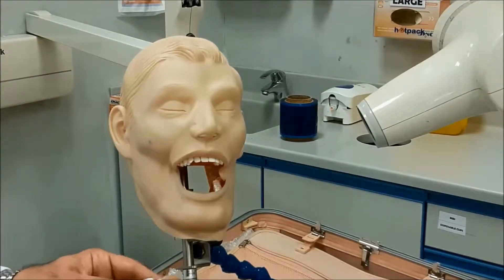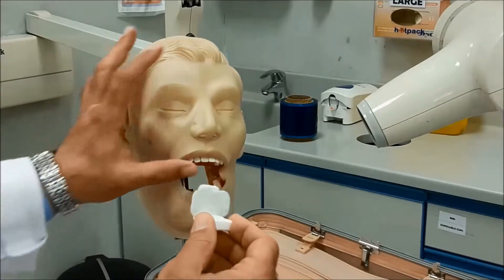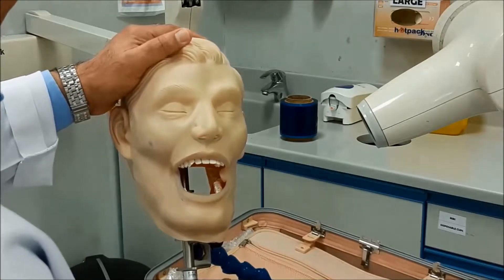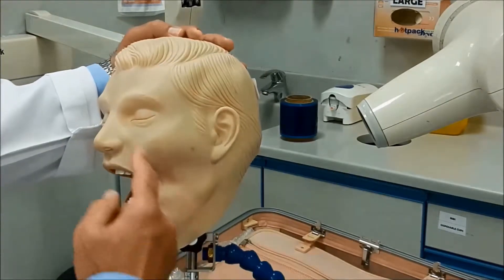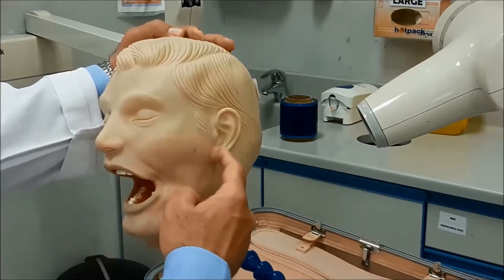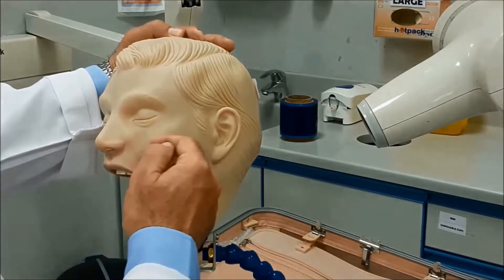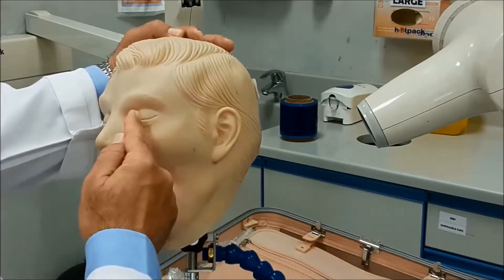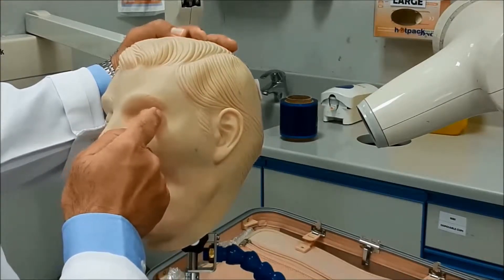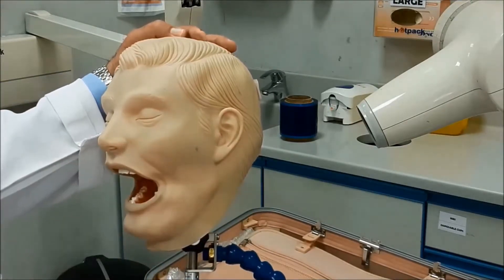When it comes to molars, upper molar film placement is the same but our reference point will differ. For pre-molars, we drop a line from the pupil downwards on the ala-tragus line. For molars, we use the same ala-tragus line but instead of dropping it from the pupil, you drop it from the outer canthus of the eye — a perpendicular line down to the ala-tragus line. This is your reference point for the molars.